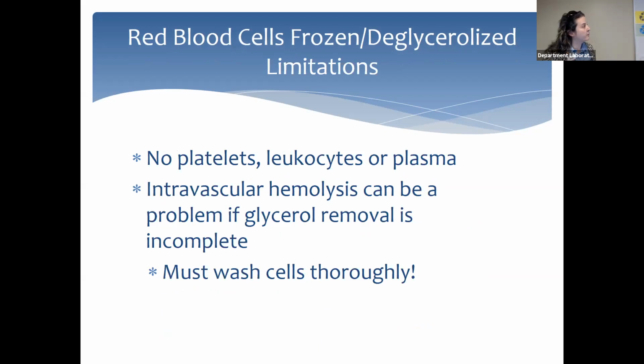Some limitations for our deglycerized red cells: no platelets, leukocytes, or plasma. Again, just strictly red cells. And again, it can cause hemolysis if glycerol is not removed appropriately. So make sure you have good cell washing.